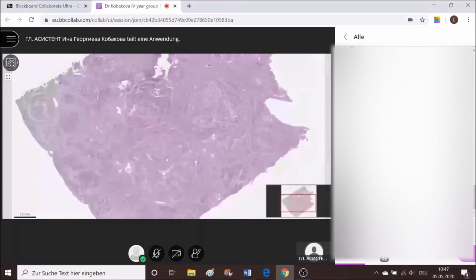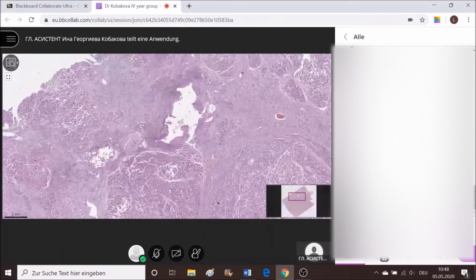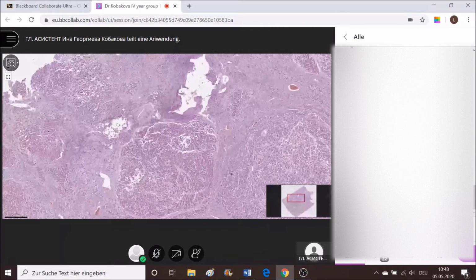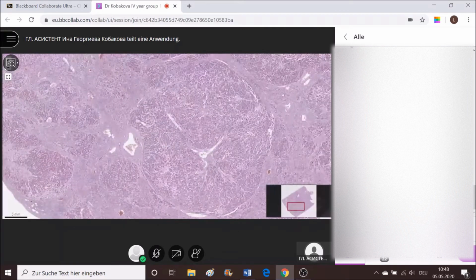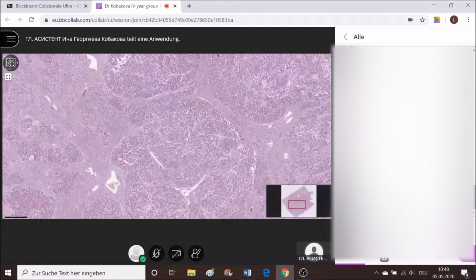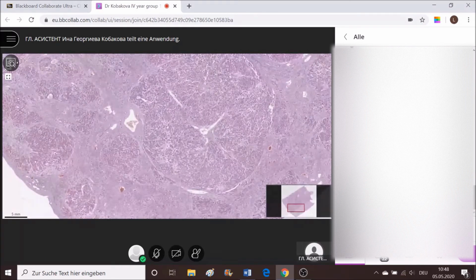What do you see here? To call something with a diagnosis, you should be able to give a proper description. Do you see central veins? Do you see portal tracts? What is the condition of these structures? How are they appearing? And what is wrong with the hepatocytes on the inside? Inside these nodules, regenerative nodules, we call them.